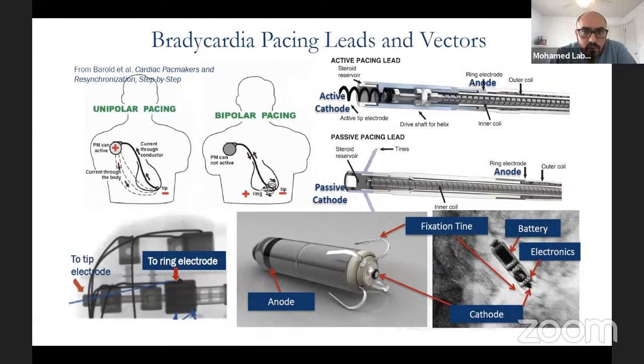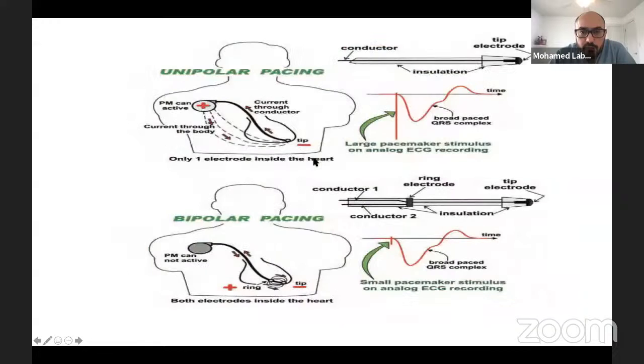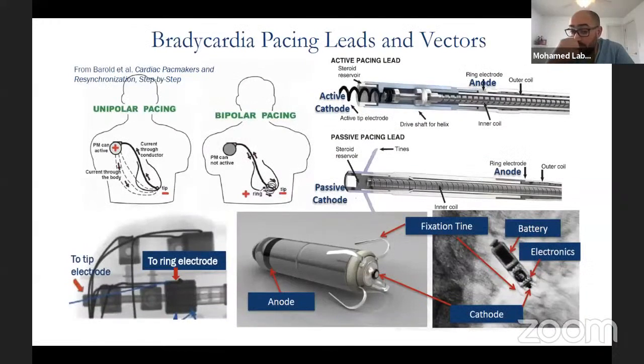Last time we stopped at this slide. The first part of this lecture, as Yusuf said, was basically bradyarrhythmia as an indication of pacemaker. So I'm going to try to focus on the basics, يعني هذه القواعد الأساسية للpacemaker, and the basics of troubleshooting of common problems. It doesn't go over the details.